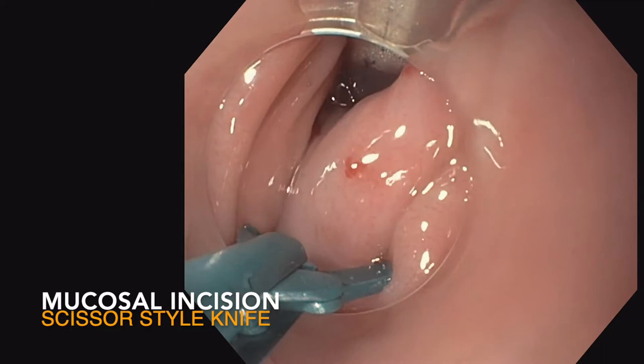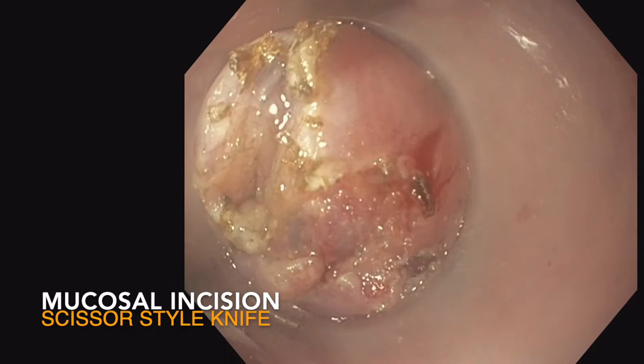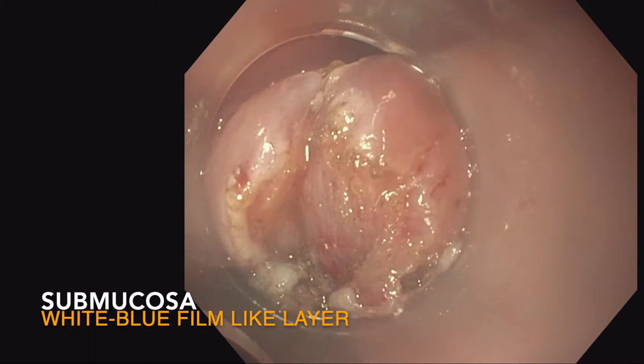Here you're seeing the initial mucosal incision with that scissor-style ESD knife — we're going to perform a cut. Oftentimes the mucosa can be rather thick in this area, though the muscularis mucosa just below it may not be as thick. Here you're seeing dissection into the submucosa, and you can see some of the blue hue picked up by the methylene blue injection performed initially.